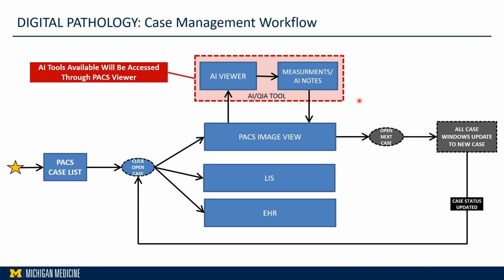So you have to have a platform to send those images or send an instance of those images, and the AI tool will receive those instances, start applying the analysis and provide back the annotations or results to the image viewer or PACS, so the pathologist can have a computer-aided diagnosis to review all these annotations and heat maps and so on, which we're going to discuss.